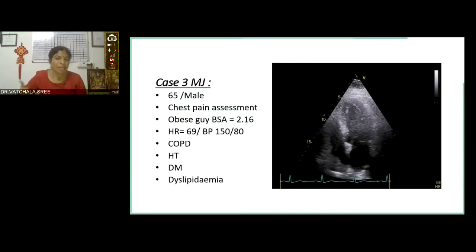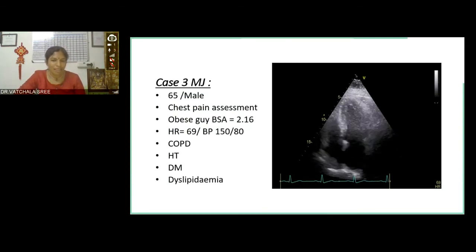I mean, to take it further, I made him walk on the treadmill. That was very brave of me. He walked about 4 or 5 minutes and he became very breathless. Unfortunately, if we had actually done an echo assessment with that treadmill, I'm sure we would have had other criteria fulfilled and he would have had diastolic dysfunction for sure.